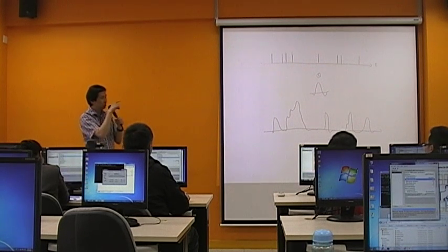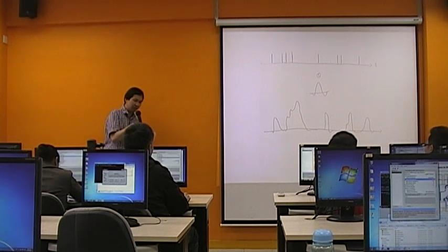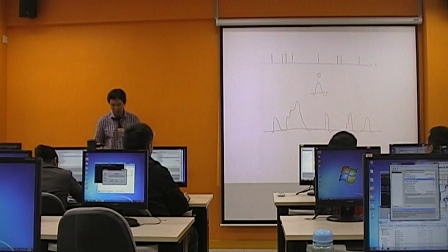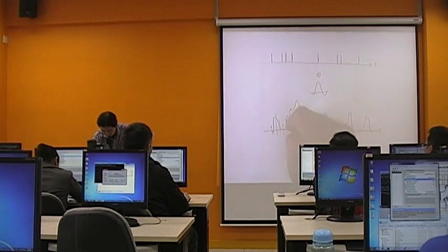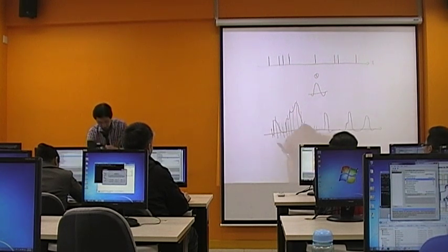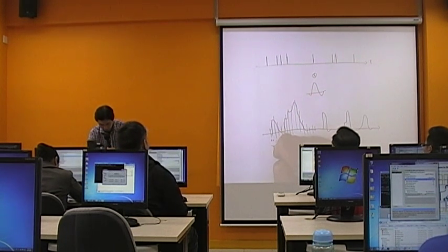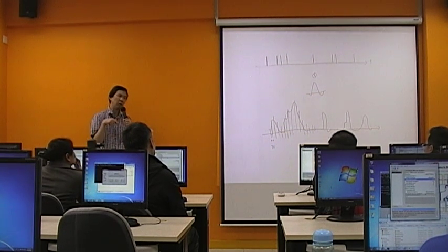So in SPM, you scale up the time resolution to build the regressor, and then you scale down the time resolution again. SPM will only take this point, this point, this point, with respect to the brain volumes. Let's say this is the time for one TR, because you only have one data point per TR.